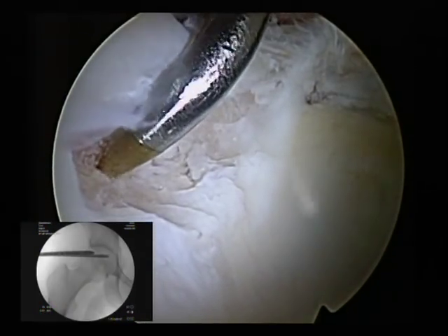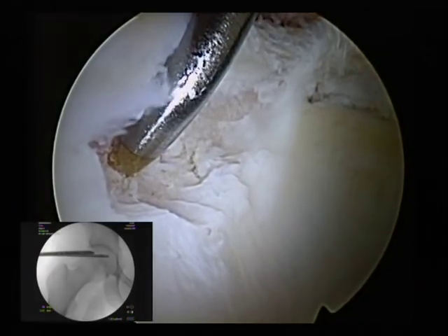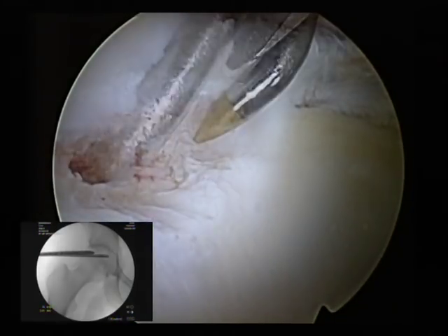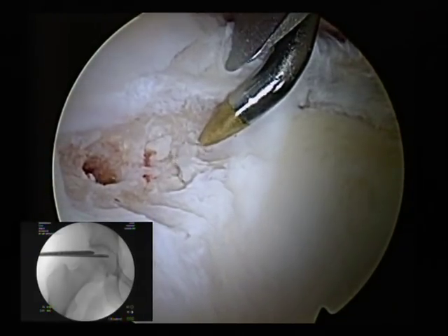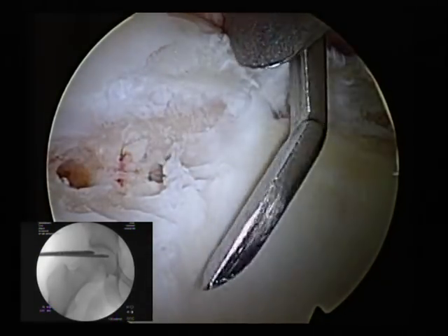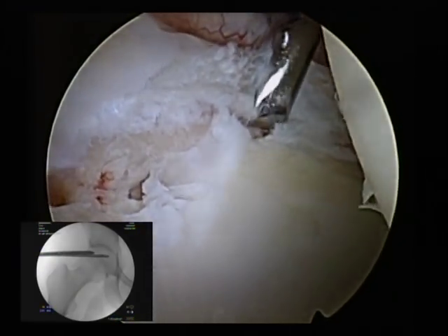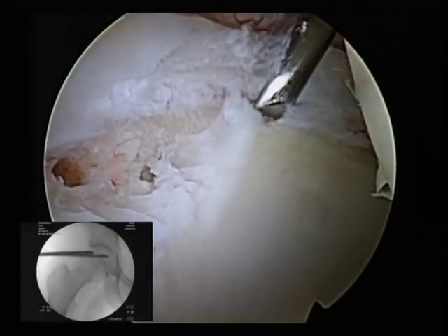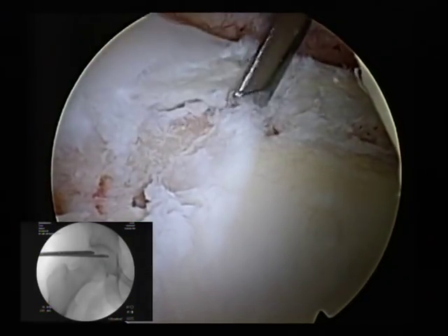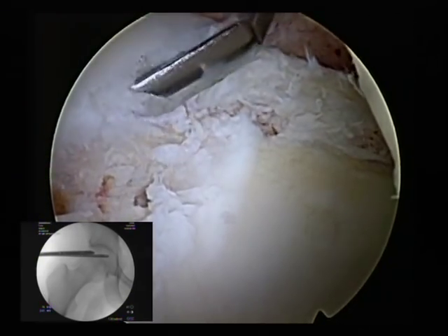This almost looks like a little area of cystic degeneration because I can perforate right into it. We'll do one more pick. We don't really want to undermine this too much because we're going to put an anchor in here. We're going to take a 30-degree angled elevator and gently try to preserve this labrum — it's pretty diminutive in this patient. So we want to make sure and preserve as much of the labrum as we can.